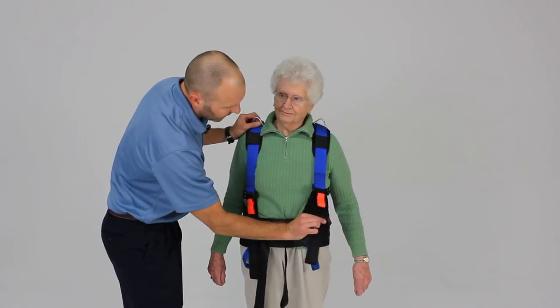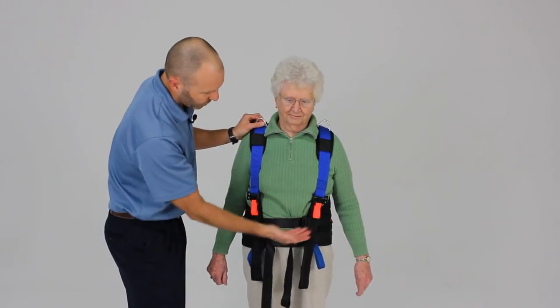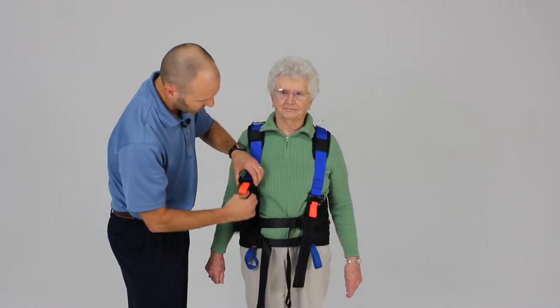Then I'm going to adjust the length of the shoulder straps by pulling down on the black webbing to shorten them. If I want to lengthen those, I just pull up on the orange webbing to lengthen for taller patients.